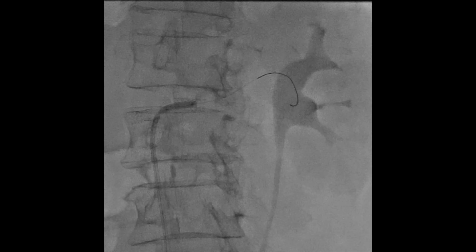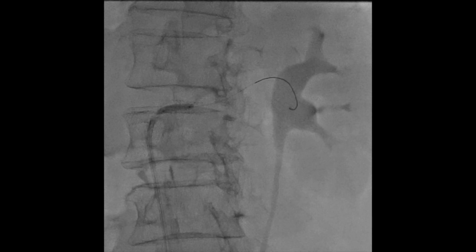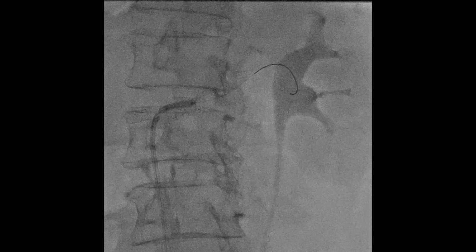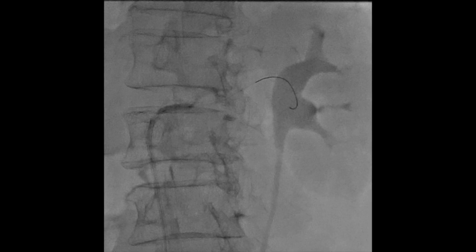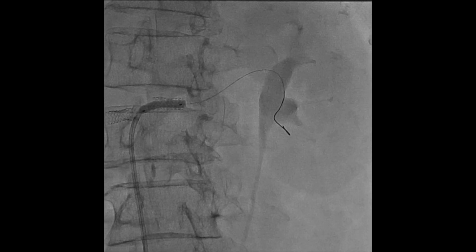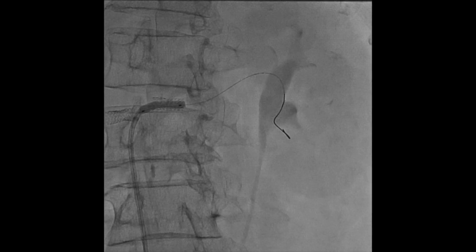Here, my problem was that I have a 5 millimeter balloon to pre-dilate the stent, but then my final therapy with the drug-coated balloon, the balloon size is only 3.5 millimeter. So I've seen some interventional radiologists and vascular surgeons do this strategy in peripheral interventions in USA, that they would apply the drug first and then use their bigger size balloon because they didn't have a bigger size drug coated balloon. So this is exactly what I did here.